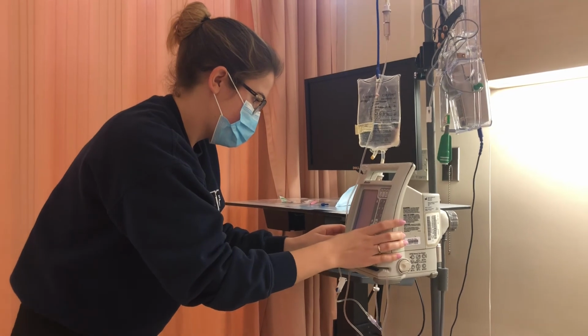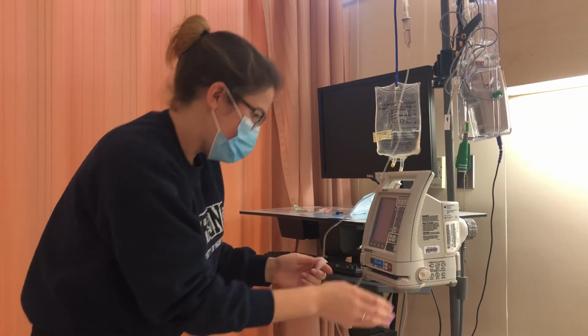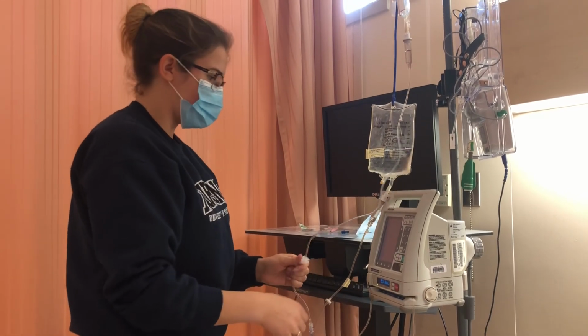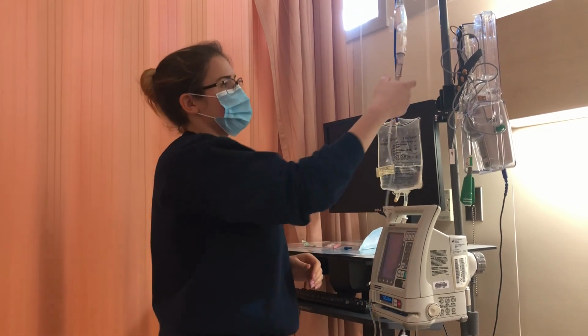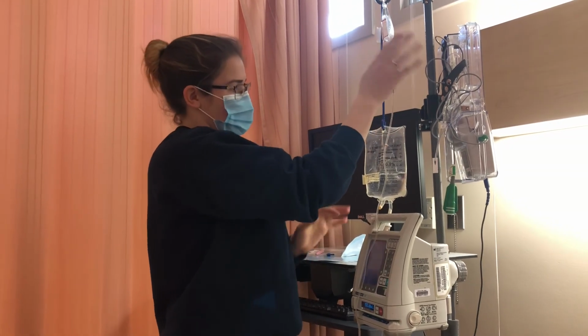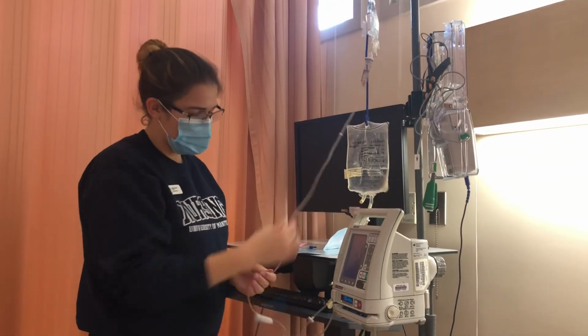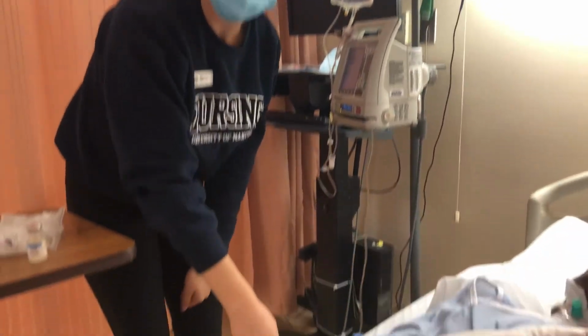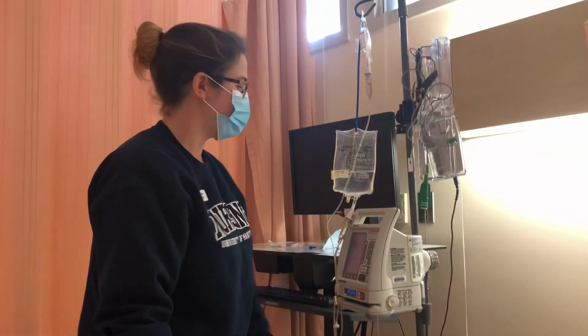Side effects of this drug could be rash, vomiting, diarrhea. So if you have any of those, we can stop the infusion. And I'm going to press start. So now it's running. I'm opening all my roller clamps. I'm checking to make sure that I'm getting 3 drips from my drip chamber. So I would just be checking to make sure everything's perfusing. I have all the clamps open, making sure that everything's running. Asking the patient if there's any pain as it's infusing, checking for any leaks, and it's okay.